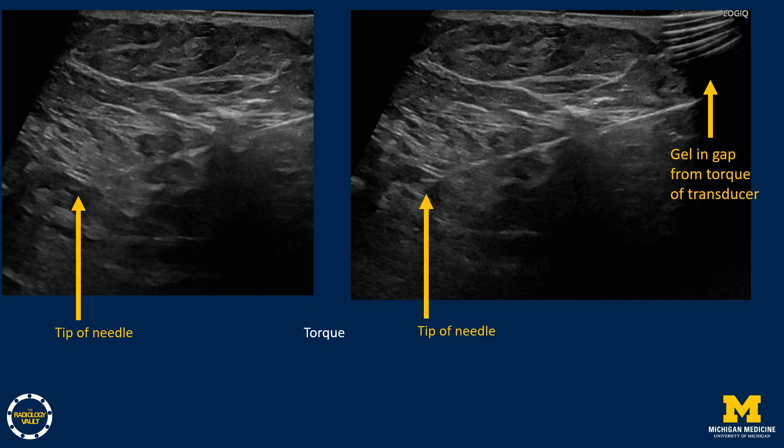For example, here is a very difficult biopsy of a deep lymph node. A virtual convex setting on the ultrasound machine was used to see a wider field of view. With torque of the transducer and the needle, you can now see a better needle tip within the target. You can also see the gel and air within the gap created by the transducer torque.